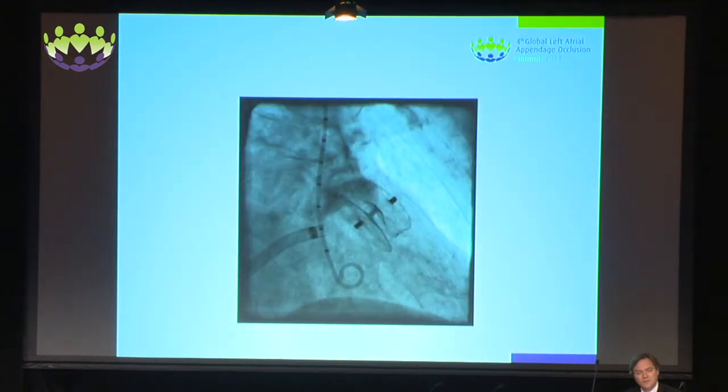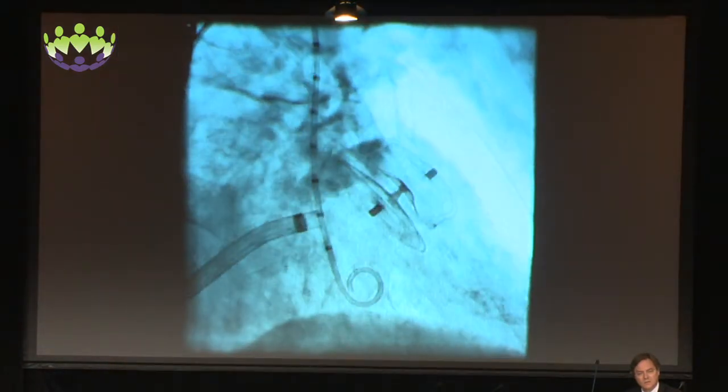Final release and final shot. I'd run out of contrast.